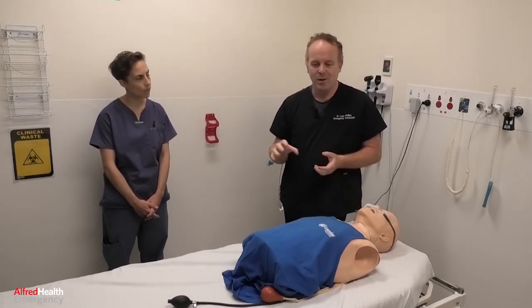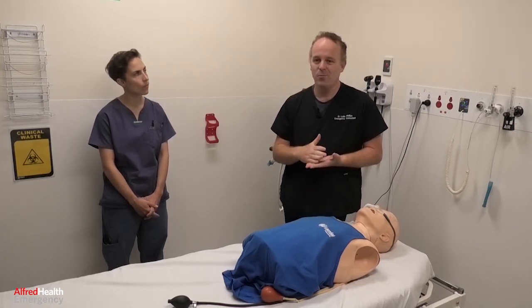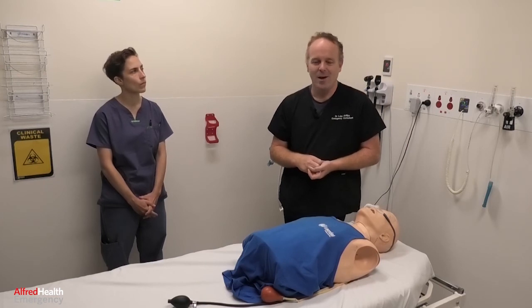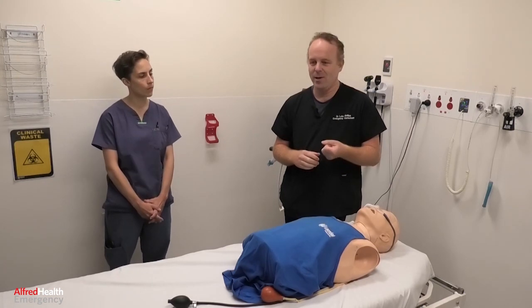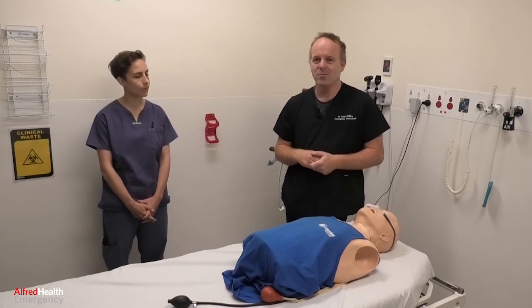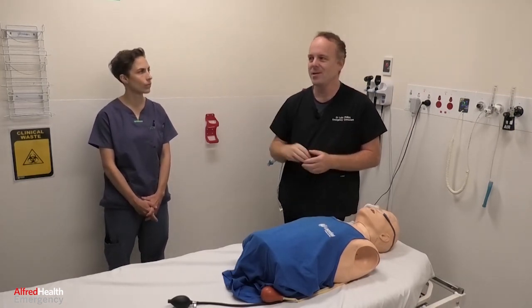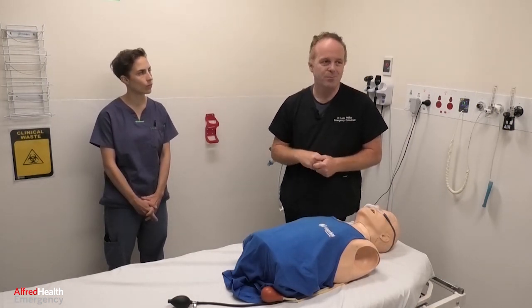The other main thing is high dose paralytics are really important, and wait the full 1 minute for the paralysis before you attempt intubation. You don't want the patient coughing or spluttering in that period where you're right at the airway. Video laryngoscope is probably the preferred option, and we're hopefully getting some disposable blades as well, so we should have enough to go around if the other ones are off at CSSD or being cleaned. And a bougie as well.